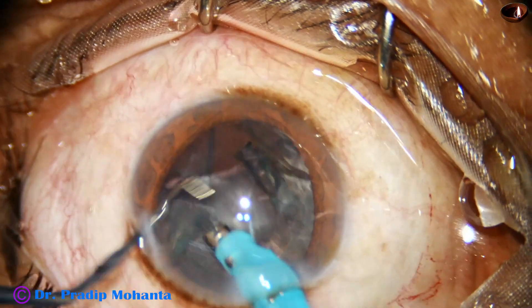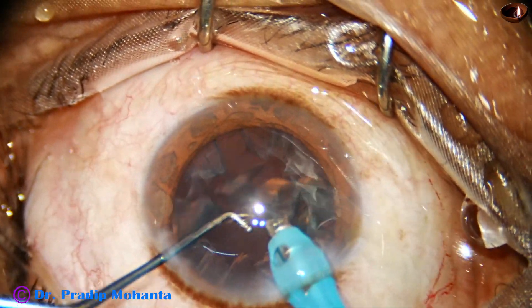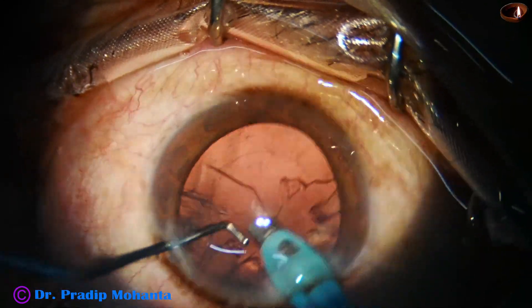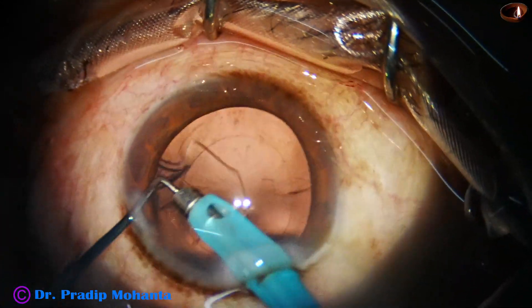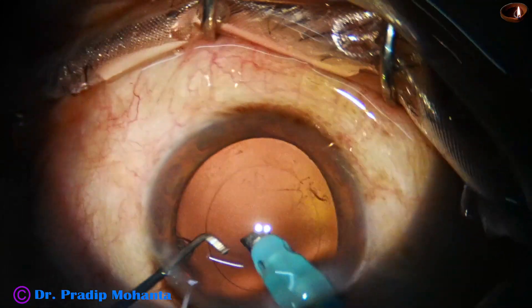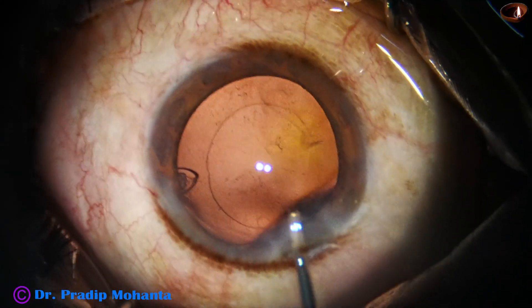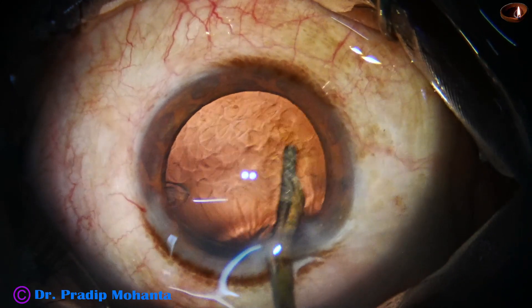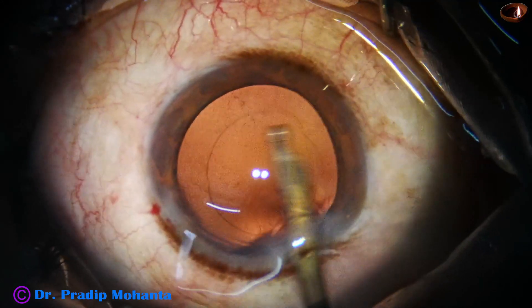The epinucleus is to be removed. At this time I ask for coaxial illumination, and I try to remove part of the cortex by the handpiece itself, taking all precautions. Most of the cortex is removed by the handpiece. I am not encouraging you to do this — when you try this initially, you are going to rupture one or two posterior capsules. So it is your decision whether you will do it or not. A little bit of cortex at 3 o'clock and 8 o'clock is removed.